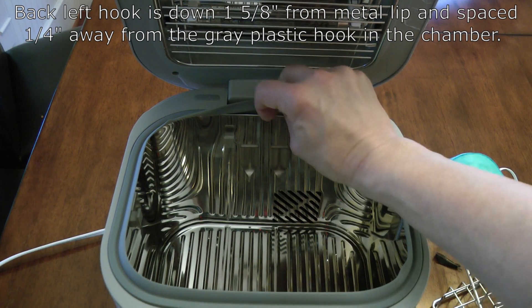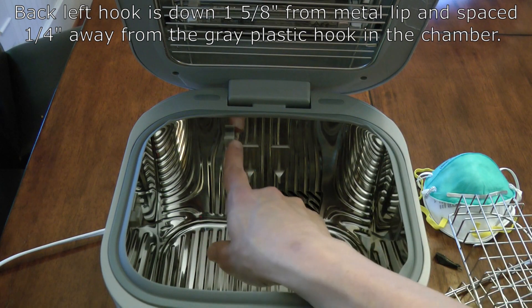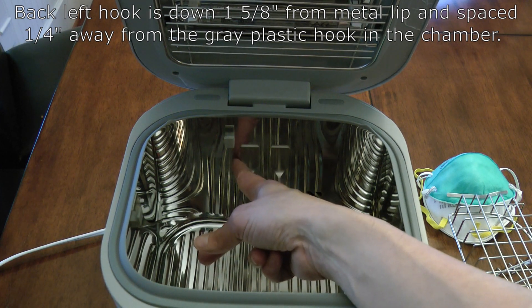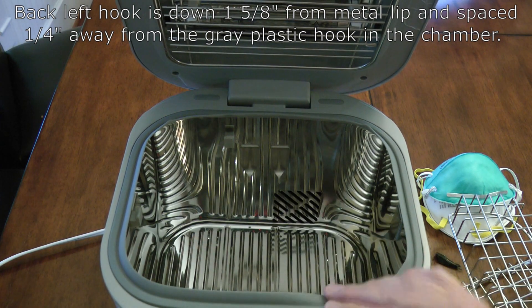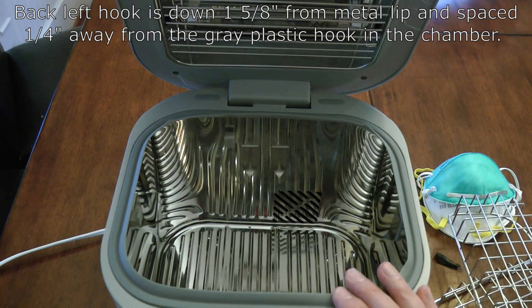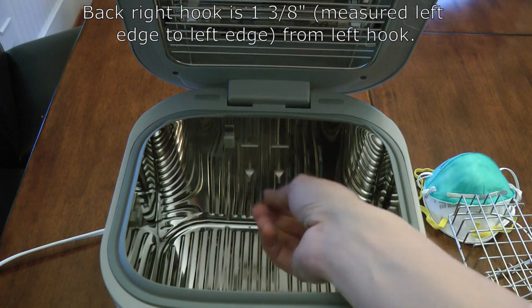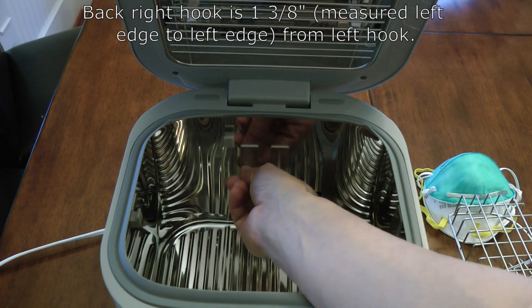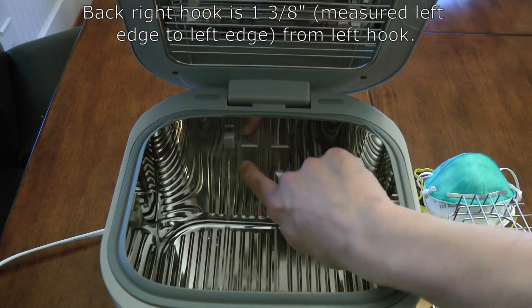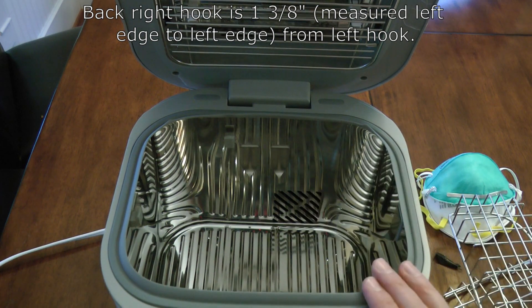It doesn't have to be precise, but it's one and five-eighths inches. Then if you go from the right edge of the little existing plastic gray hook over to the left edge of your new hook, it should be right at about one-quarter inch — so this space in here is about one-quarter inch. It doesn't have to be precise, but it's about a quarter inch. That's where the first hook goes. The second hook goes to the right of it by one and three-eighths inches — measuring from left edge to left edge.